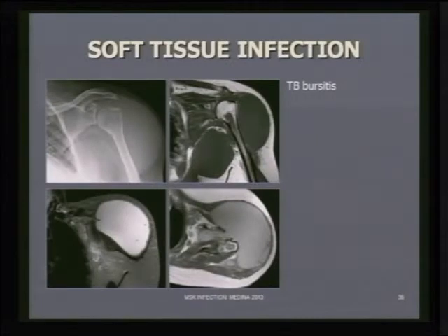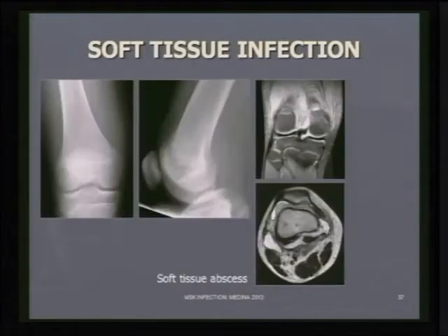But sometimes we don't see the sort of inflammatory nature of the lesion. This is a middle-aged lady presenting with a massively swollen shoulder. And a huge, what turned out to be, subdeltoid subacromial bursitis with rice body formation. And in this situation, really, there's two diagnoses we think of. Again, in the Asian population, this turned out to be a case of tuberculous bursitis. And again, note here the multiple axillary lymph nodes, which we would not expect to see in a soft tissue sarcoma. And the other condition, of course, is a first presentation of chronic rheumatoid disease.